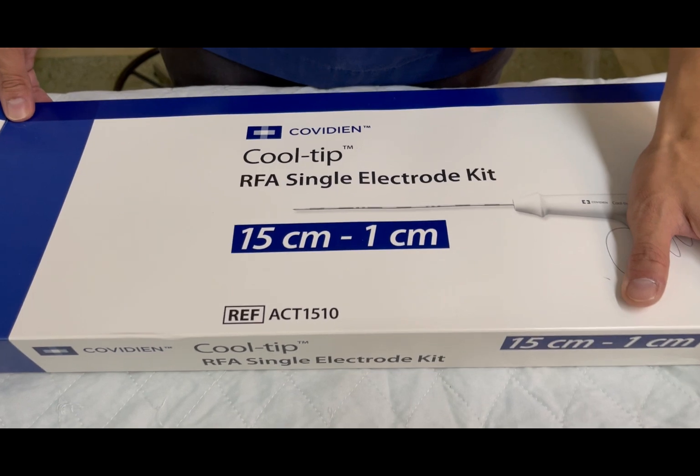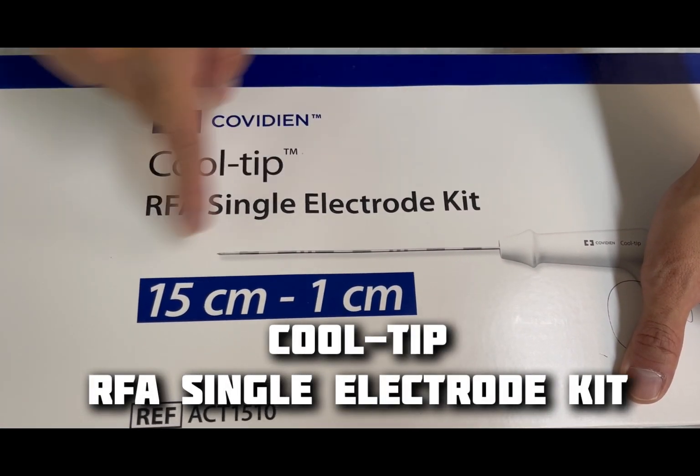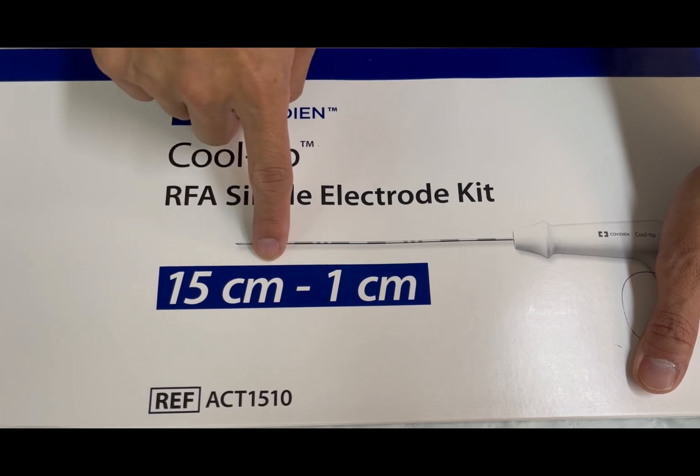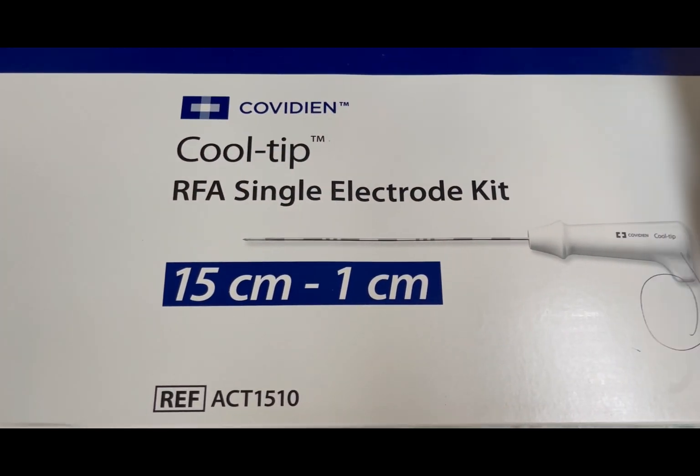There are various lengths of the RFA probe, and here 15 cm represents the whole length of the needle and 1 cm indicates the active end of the electrode.